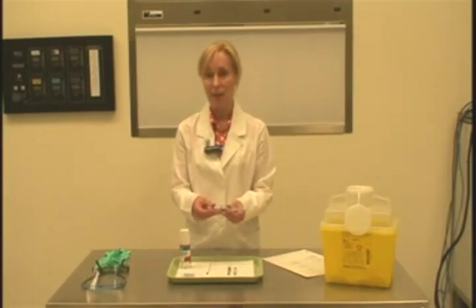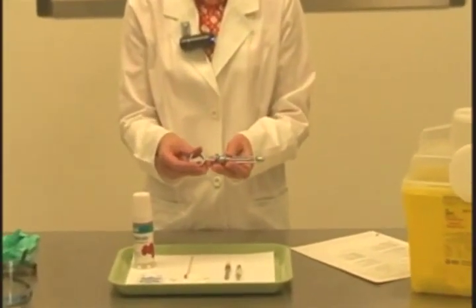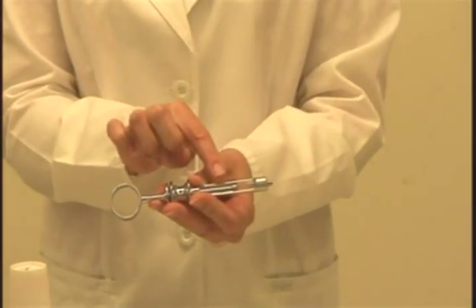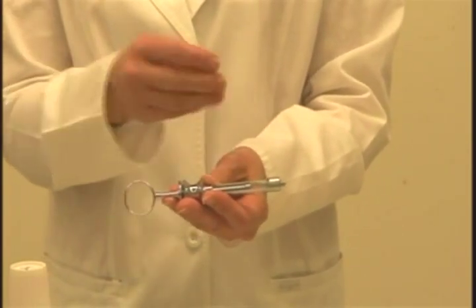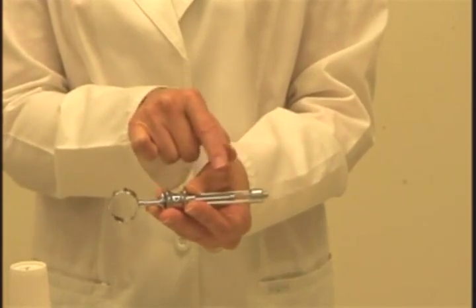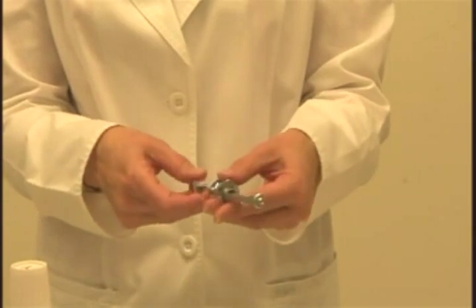We are focusing on the self-aspirating syringe, so you want to be able to differentiate between an aspirating and a self-aspirating syringe. The self-aspirating syringe has a piston without a harpoon on the end of it. The aspirating syringe has a harpoon; the self-aspirating syringe does not. Make sure you appreciate the difference and can select the correct syringe.